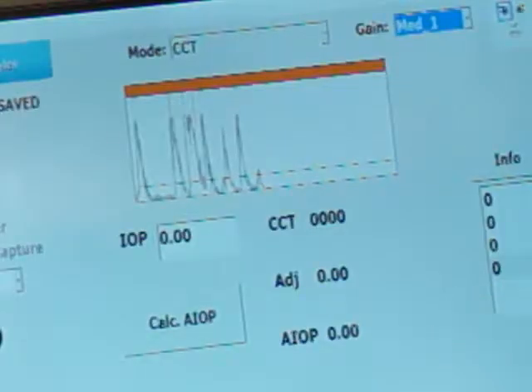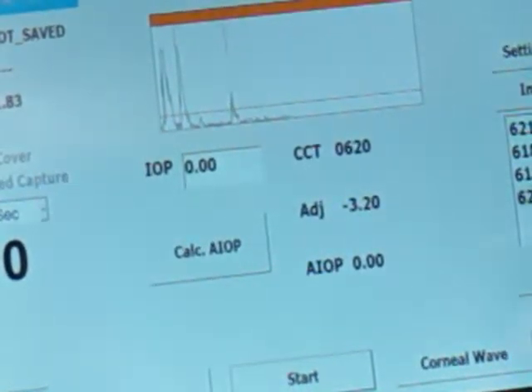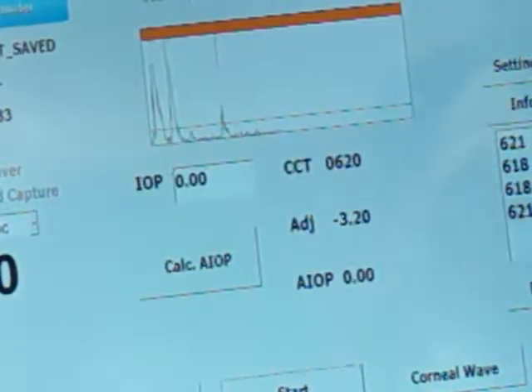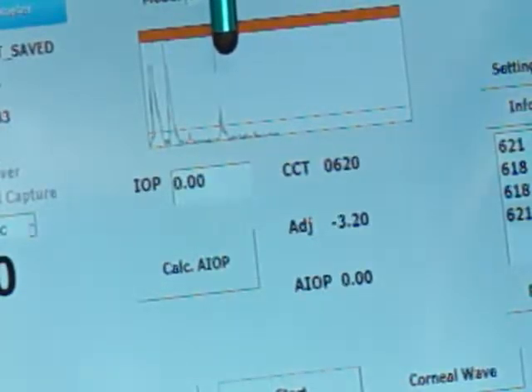So when I apply it to the cornea, get ready, you will get a perfect reading. Okay, and this is what you want to get in the cornea. You want to get an anterior corneal spike and a posterior endothelial spike.